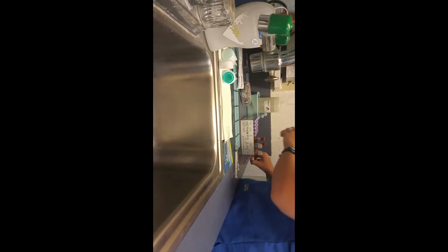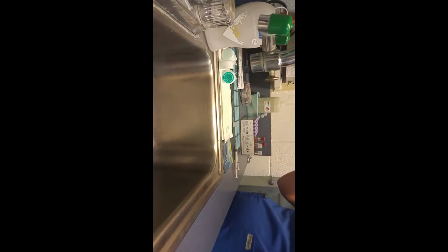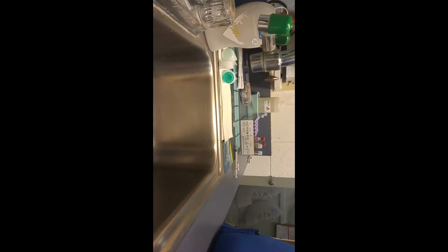Okay, so we'll go ahead and take them out. And it's definitely colorless. There's no color to the supernatant. It's very clear. So we'll go ahead and pipette out the supernatant on top, and then we'll have just the washed red blood cells on the bottom. Careful not to disturb the red blood cells that are sitting on the bottom.